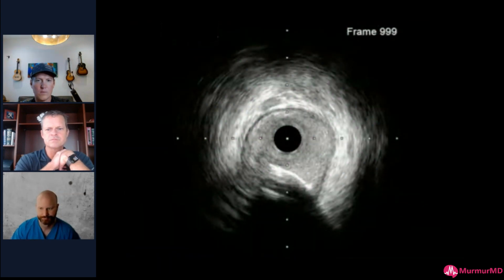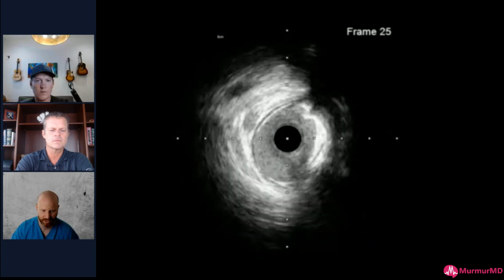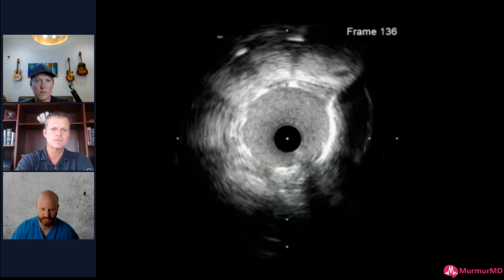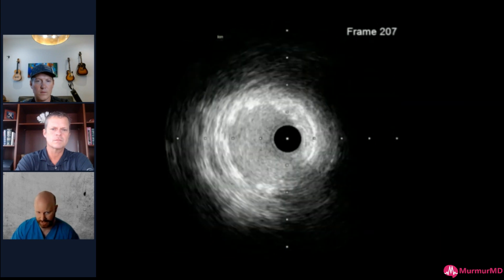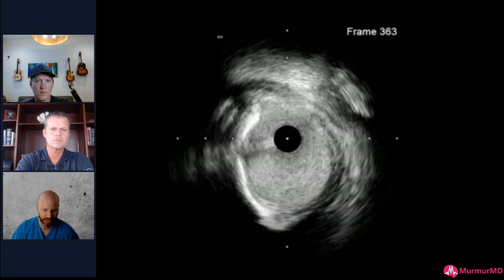Awesome. That's great, dude. I think the recurring theme with all of these cases is that imaging and physiology is critical, and if you're not doing it, you're doing your patients a disservice, especially if you're going to be modifying calcium. So that's super helpful. Completely agree. And I think that I have not been more tricked by angiography than this year. I mean, there have just been so many cases where we did angiography, then we did physiology and it was positive, and then we went and IVUS'd and there's a napkin ring or there's a nodule or there's a whatever.